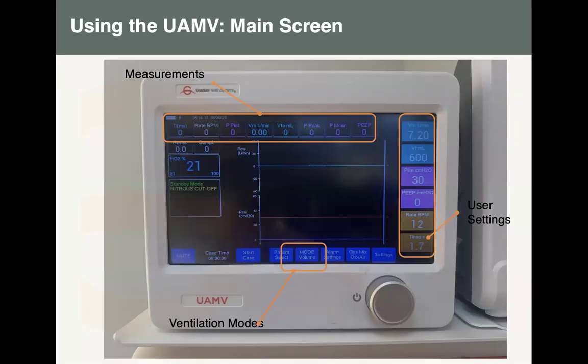So I remember before, when we were ventilating with the bellow, when we panic, maybe you are using the 2-liter bellow, you may end up pushing all of the air to the patient, and no one needs 2 liters to go to the chest, or even 1 liter. So the machine will always guide you to make sure you are setting according to the patient, and you also have to monitor and say whatever I'm giving is the one which goes to the patient.